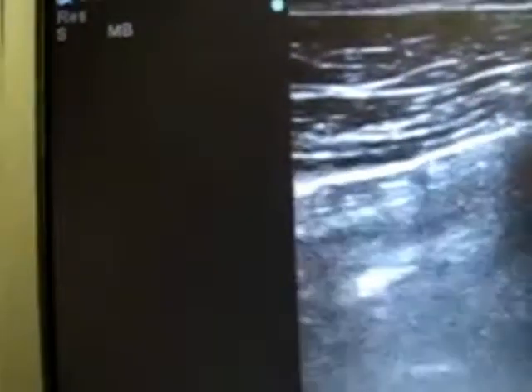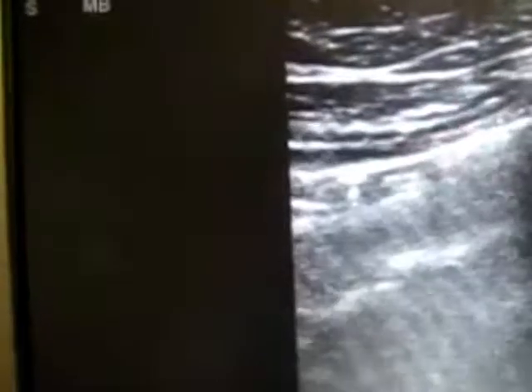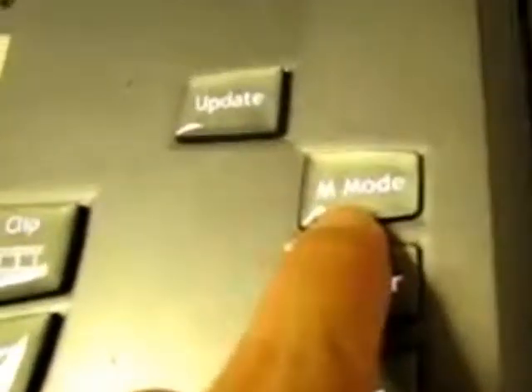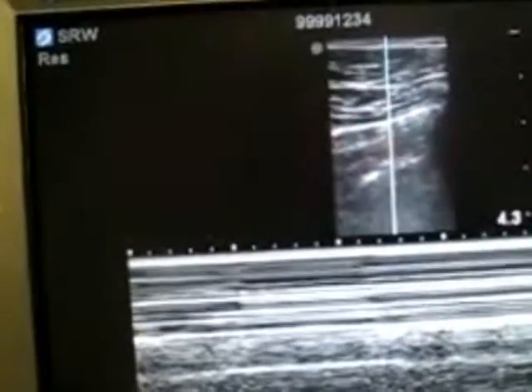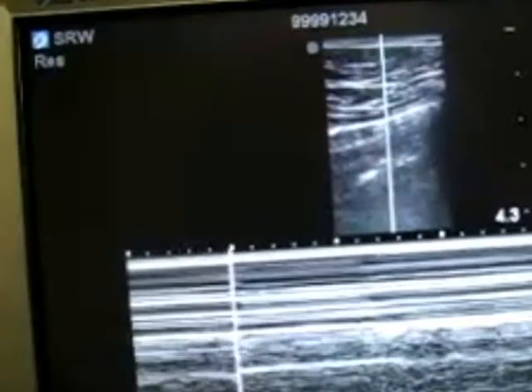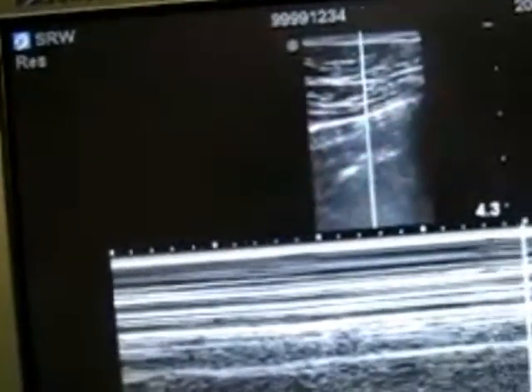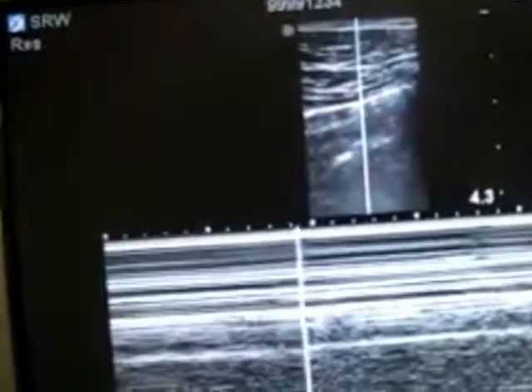Here is a picture of lung sliding with comet tailing, as obtained during the EFAST portion of the trauma evaluation. If the findings are subtle and you cannot be sure that there is lung sliding, you can place M-mode on, which is done by pushing the M-mode key. At that point, a green line will come up and you can place it through the pleural lines between the ribs to obtain an evaluation of motion.